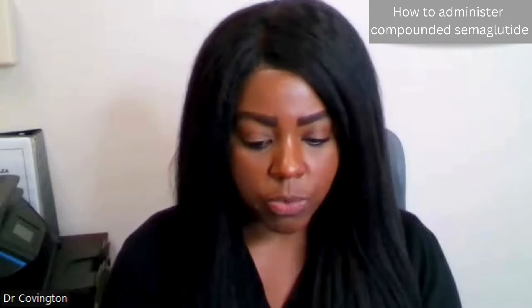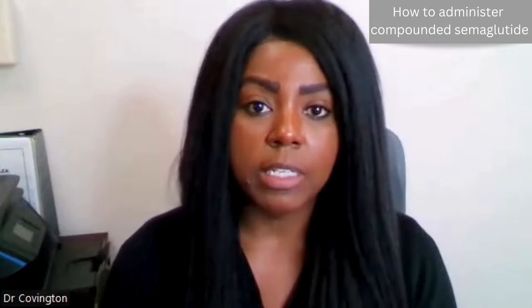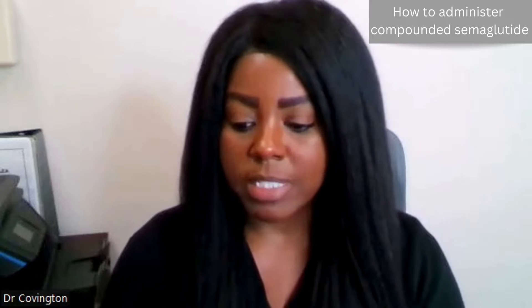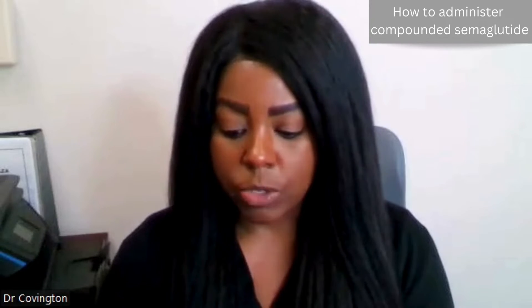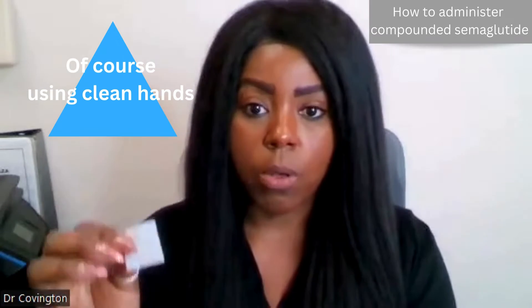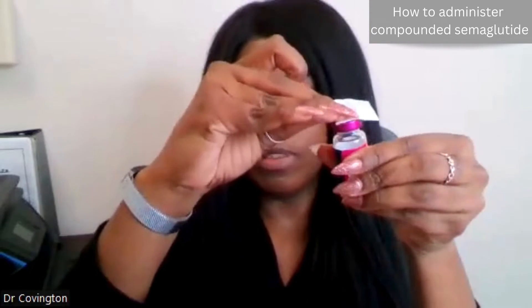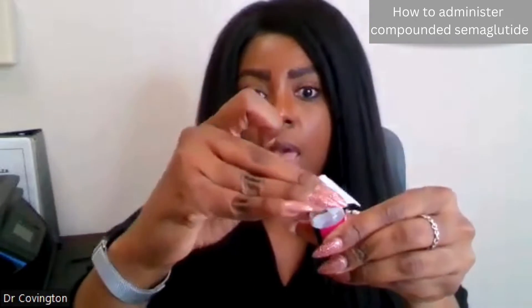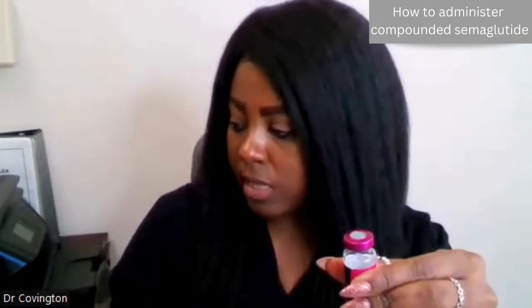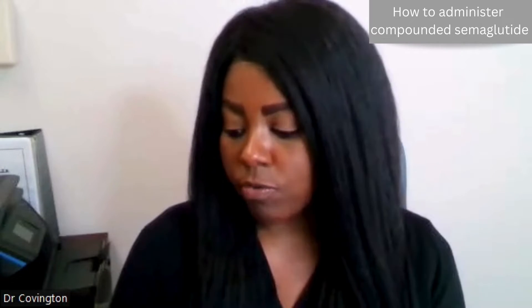If we're starting with this injection, for this particular vial, it can be done at room temperature and kept at room temperature. For different compounding pharmacies, that may vary, but that is included on our instructions. First step is that I am taking the alcohol wipe and wiping the top of the vial. This vial has a rubber stopper. We want to keep the edges on because that's what stabilizes the stopper for this particular vial.